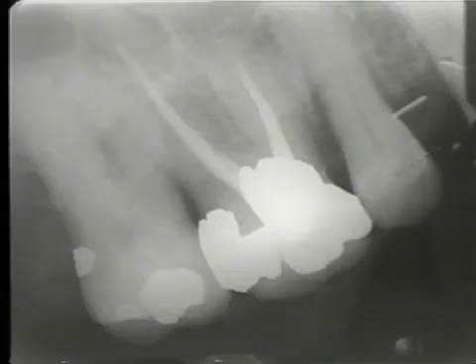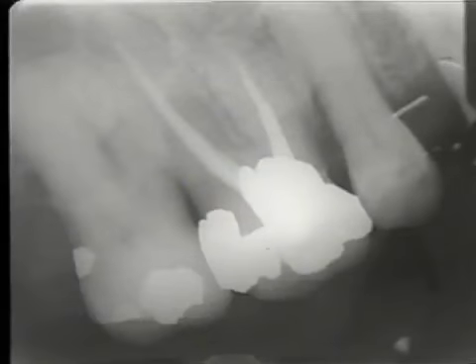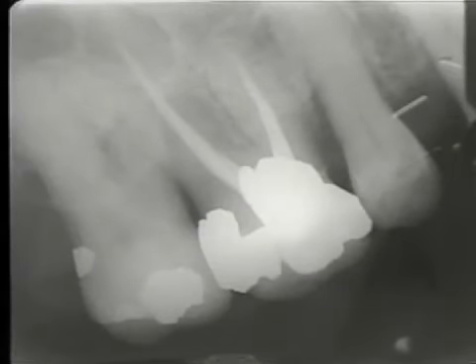The distal buccal root is removed, and we can see the amalgam in the pulp chamber where the root formerly was located. Before the patient is dismissed, we make sure the tooth is out of occlusion, and we instruct him on oral hygiene and the necessity of having the tooth restored with full coverage as soon as possible.